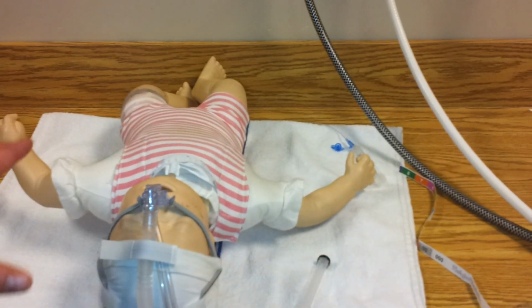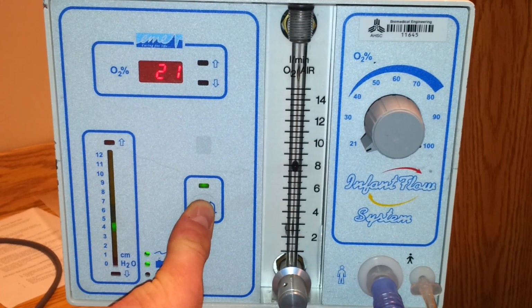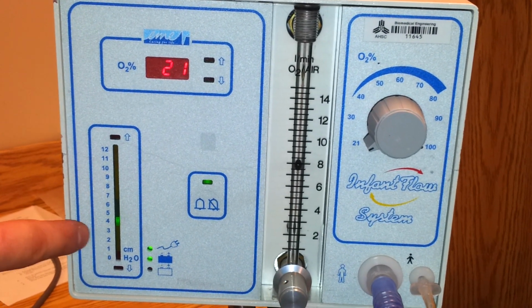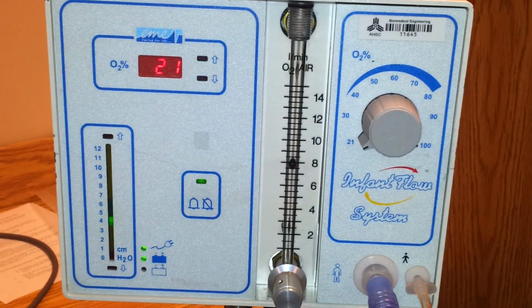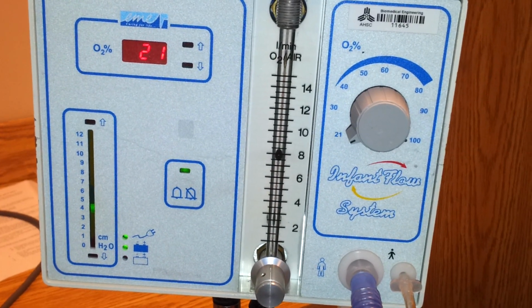So once the baby's fine and everything's hooked up, we're going to go back to the ventilator. To set the alarms, once you're happy with the FiO2 and PEEP, there's a little alarm button right here. You hold it until you hear 3 beeps, and let go. That basically sets it so that the alarms are 5 above and below the set PEEP and FiO2. So you always want to document appropriately, including the vent start sheet.